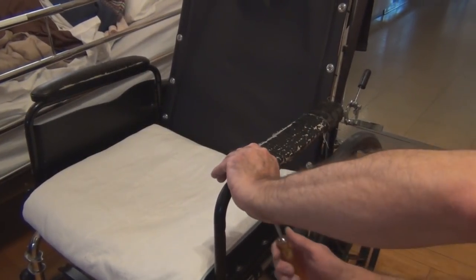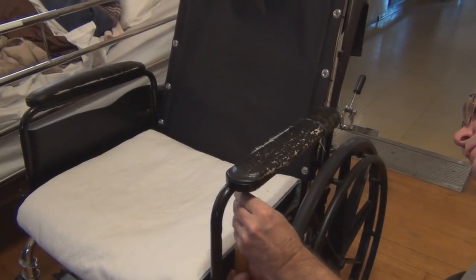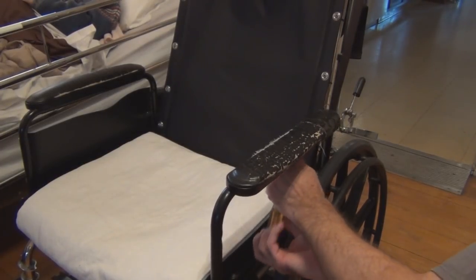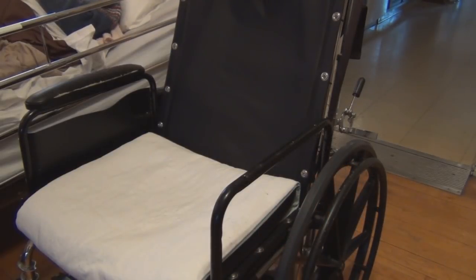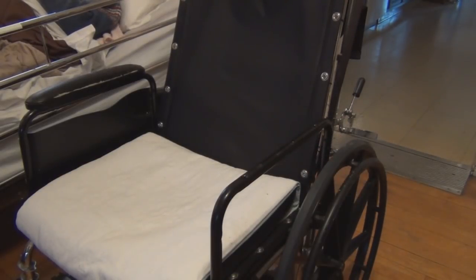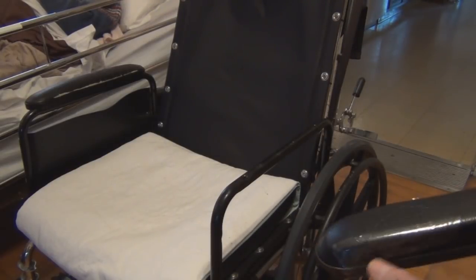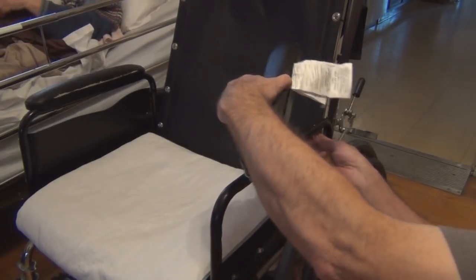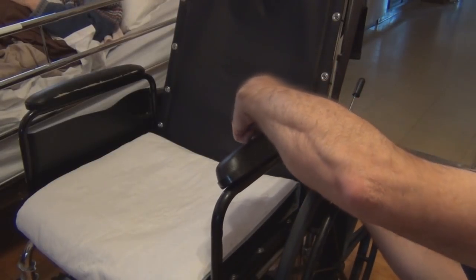Now the armrests — they just have two Phillips head screws here. Remove those, and then these are the replacements. They come with screws and those labels you're not supposed to remove under penalty of — blah, whatever they say. They have multiple holes for whatever spacing you're able to accommodate on these.